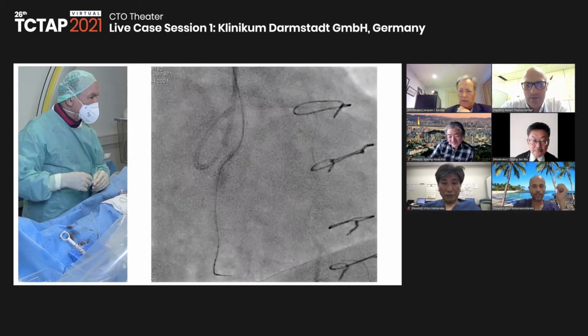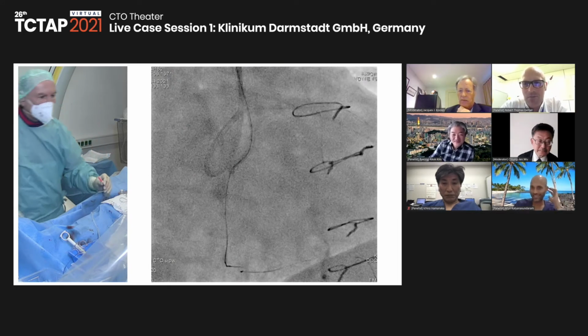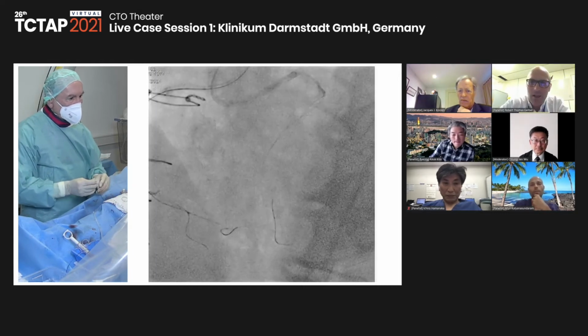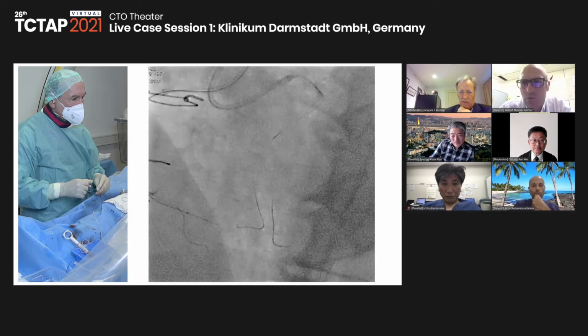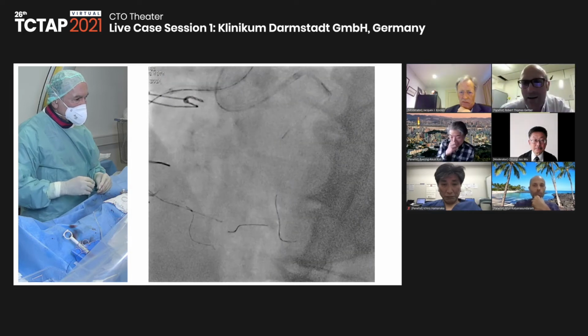Okay, that looks good. Move down a little bit. Well done. Now if the Caravel doesn't go, no, that's good. That'll be controversial. The other thing I find with the Caravel, I don't know whether other people do, is that because it conforms nicely, particularly in tortuous vessels, even with short guides, you run out of space. And that can be really frustrating sometimes.